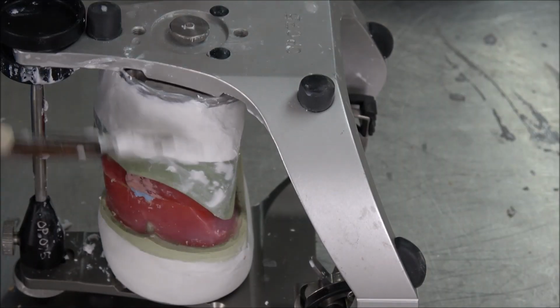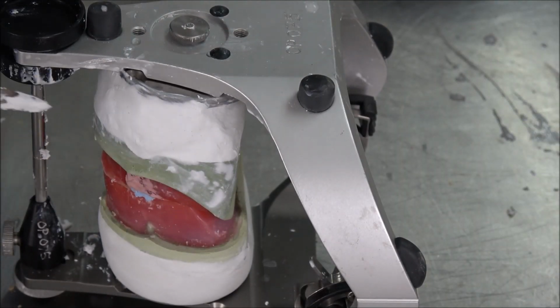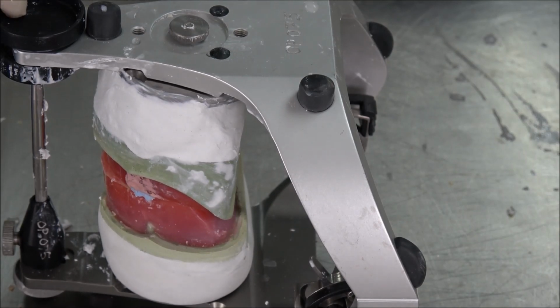Okay, so we just roughly do it. If it looks a bit rough here, it's okay, never mind. So make sure you don't move your articulator, don't turn your articulator, turning is not allowed. Just leave it in the same position like this. Just leave it until it's set.